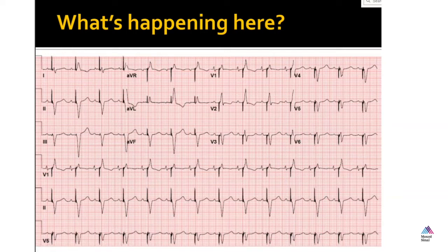Yeah. Hi, Dr. Bass. So, morning. I'm looking at the tracing, V1 and lead 2, and I'm seeing a pacing spike before each QRS, and it's after the P. So I think we are V paced. Is this a dual chamber or a single chamber pacemaker, you think?